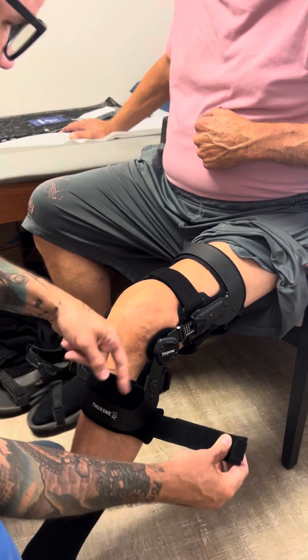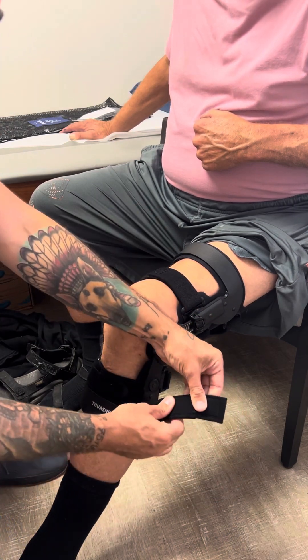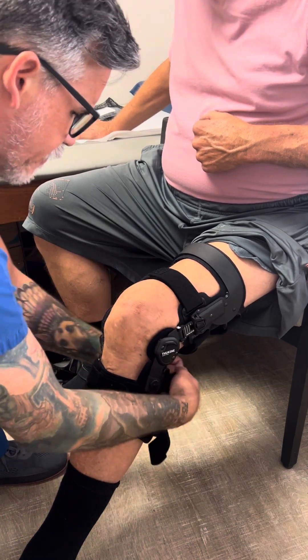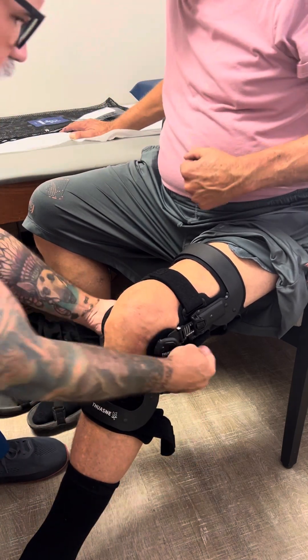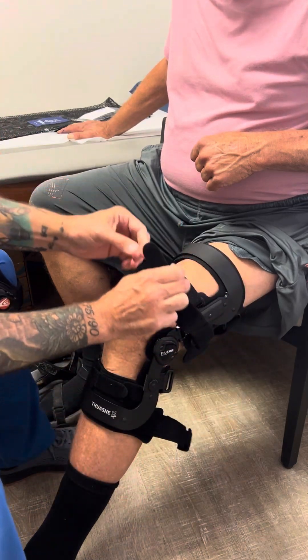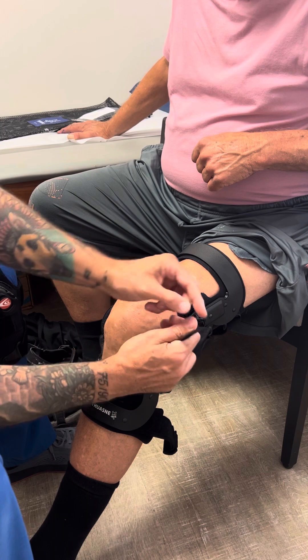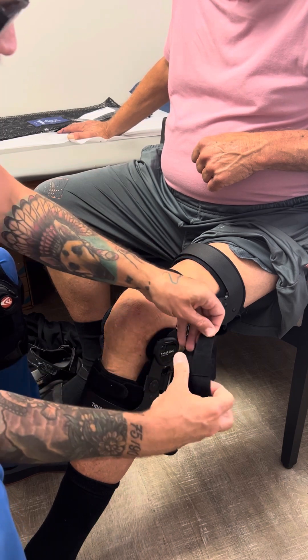The straps crisscross right, left, right, left. Every time you take a brace off you want to undo the strap and fold the strap back to itself so they don't get all crisscrossed and caught up on each other. When you're looking for the straps, there's a little circular end to the strap that doesn't have velcro right on the end — that's how you make sure you have the end.